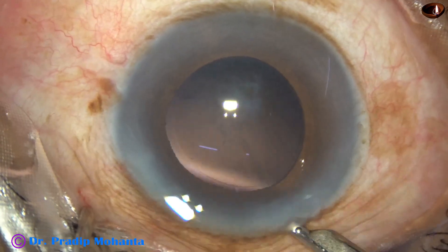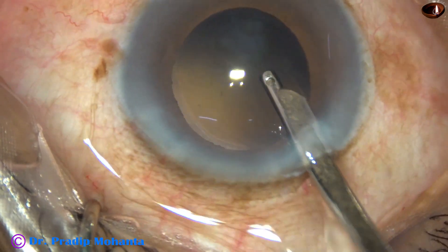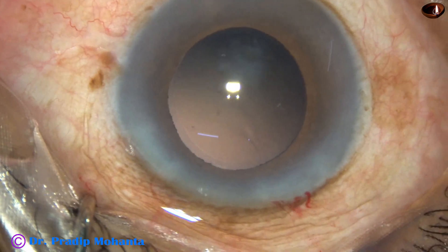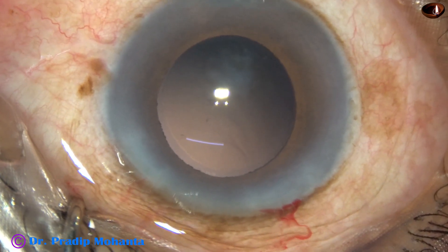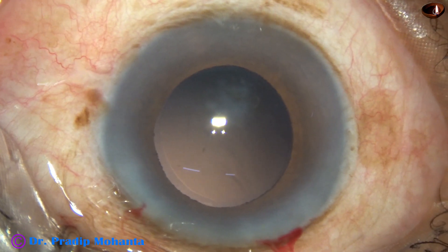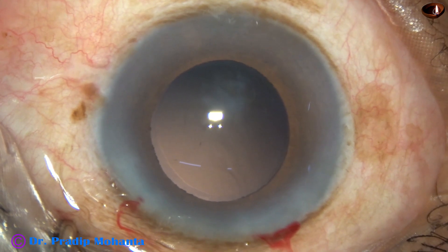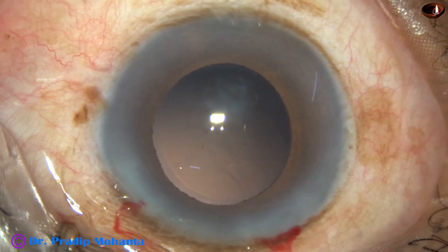There is some fibrosis of the posterior capsule near the 7 o'clock equator. We do not have to do anything for this because the central 3 mm zone is clear, and these fibrosed areas usually do not extend.